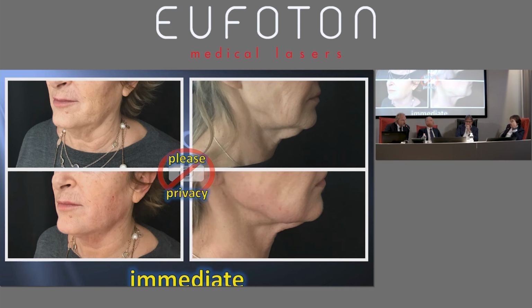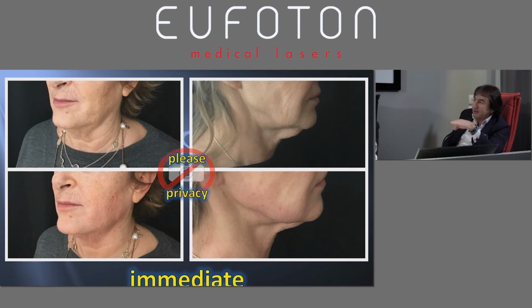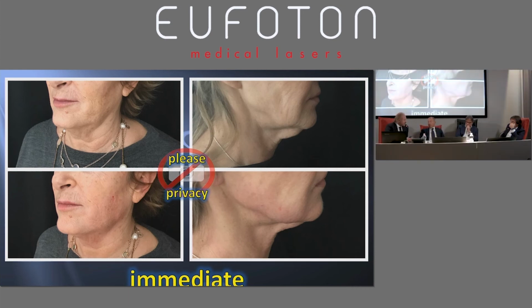But I was thinking of something. During the treatment, according to your experience, do you change the cleavage plane, changing the power? When I see a lot of adiposity, can I go deeper with a higher power and then go up to the surface?